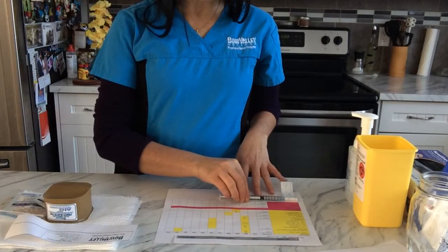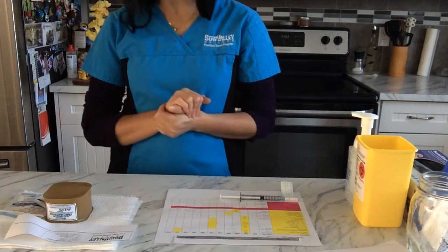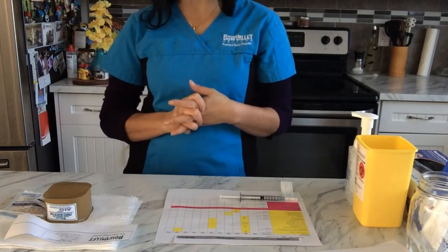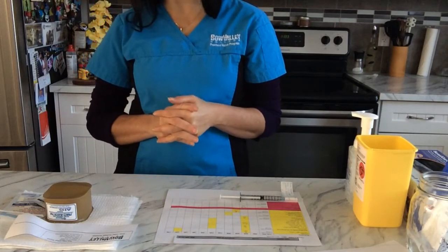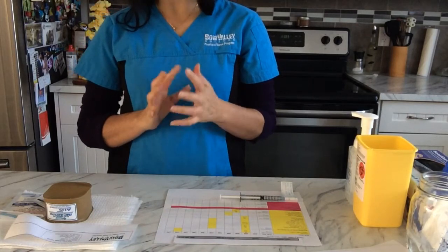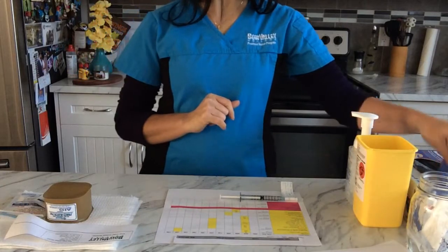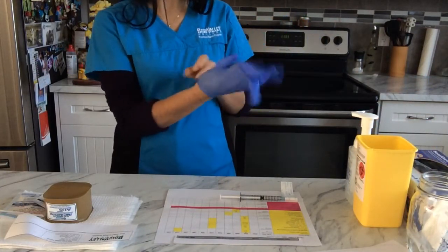So I'm gonna ask her, doctor ordered some heparin for today. Have you had heparin before? And she says yes. Which side do you usually have the heparin? And she says on the abdomen area. So I'm gonna assess the skin, if it's okay, and she said yeah. So I'm gonna grab some clean gloves.